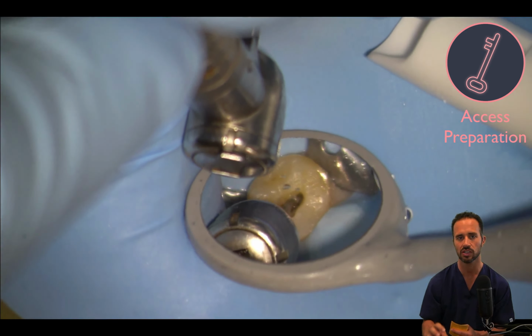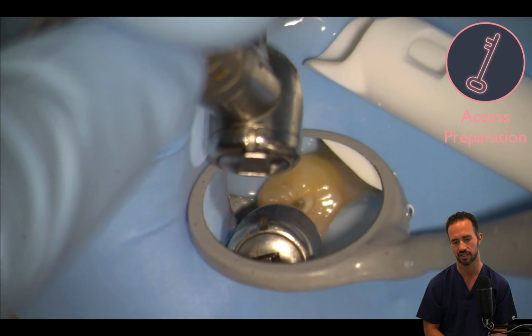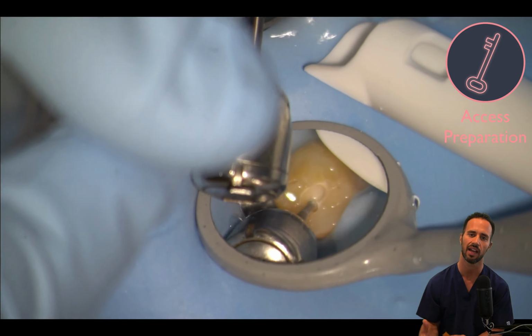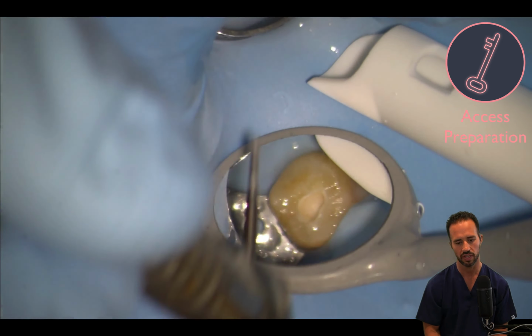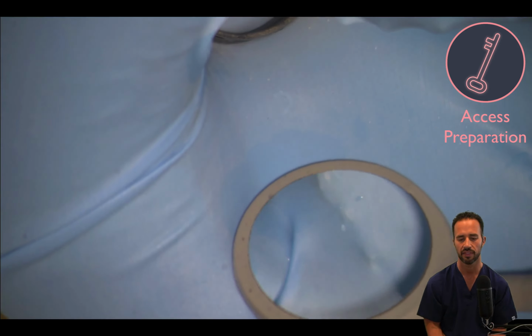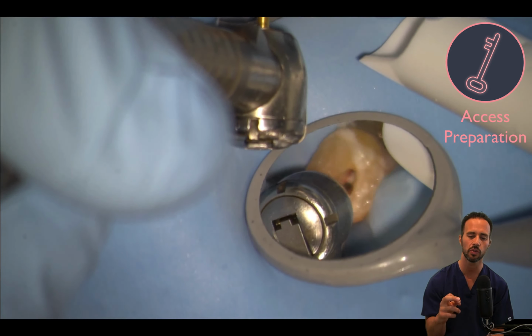Take your time, as always, with your access preparation, because it's going to make all the difference, and it's really going to set the tone for the entirety of the endodontic procedure. So I'm just slowly removing the dentin and unroofing the pulp chamber. And now we're reaching for our Endo-Z bur.